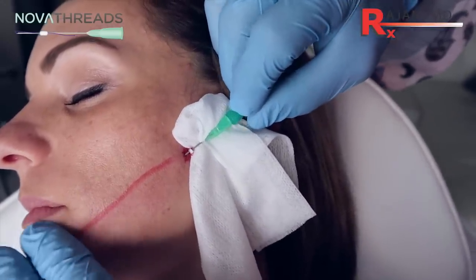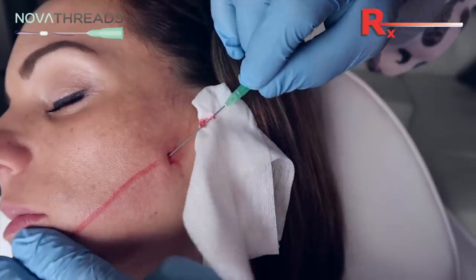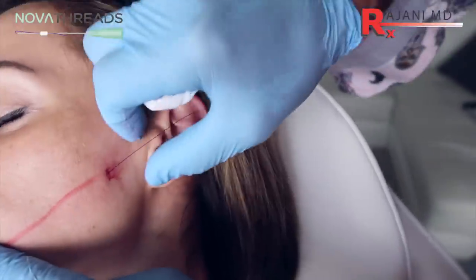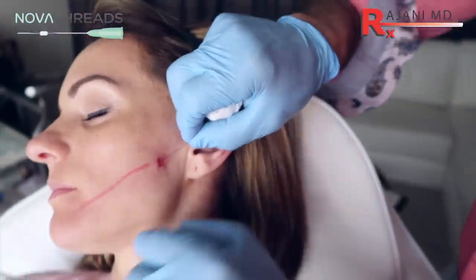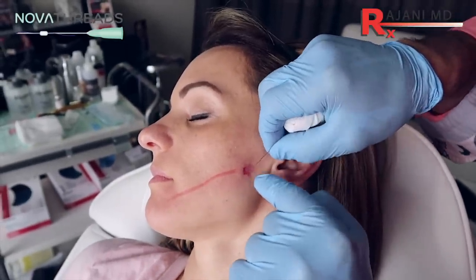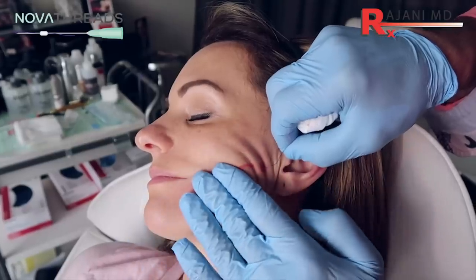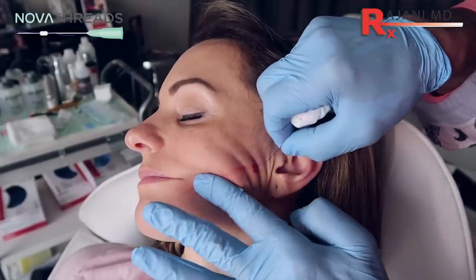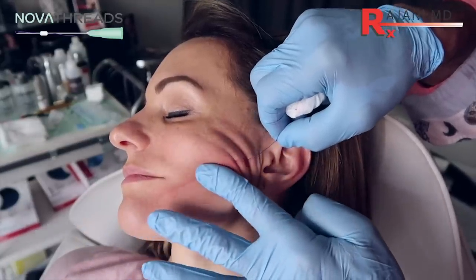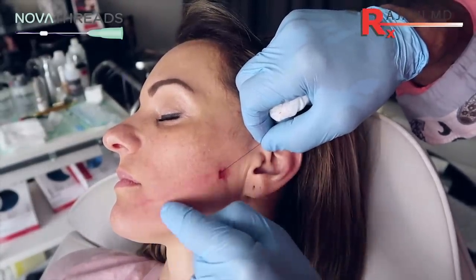I feel it here. I'm going to twist to anchor the thread, then pull out. I hold it with a little bit of tension — you can see it pull. You can see these barbed barbs are amazing; it's grabbing beautifully, that's a lot of pull on that. I engage the thread pulling up and I can feel it just chugging up — click, click, click — lifting the edge. You can already see that fold is gone.